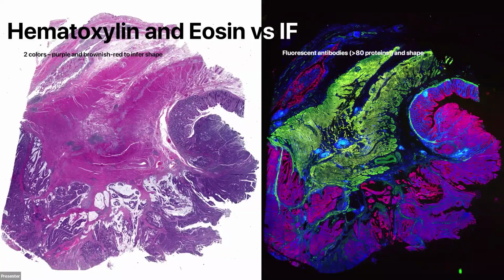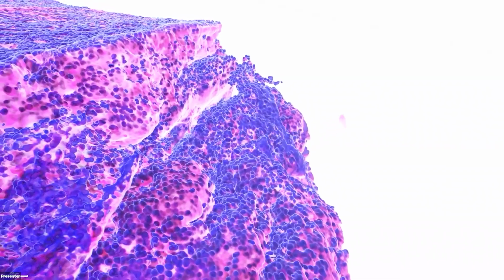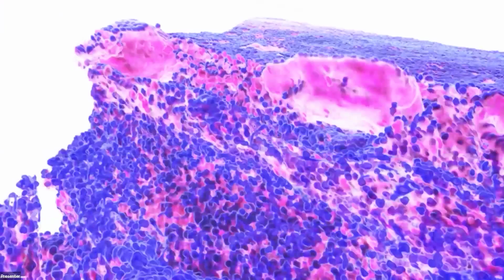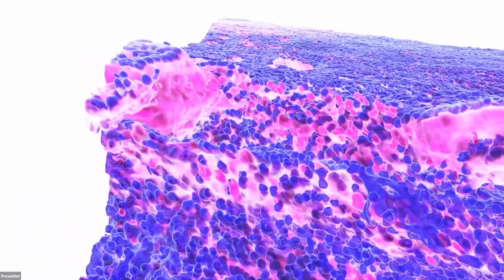How might the future look for 3D imaging, specifically of clinical samples? Well, one such tool that is already very popular is the ability to generate pseudo or virtual H&E images that are familiar to clinicians. This is generated from a fluorescent nuclear stain and tissue autofluorescence. This is becoming a valuable procedure to do because it gets clinicians engaged with our research to help us identify interesting biological questions in healthcare.